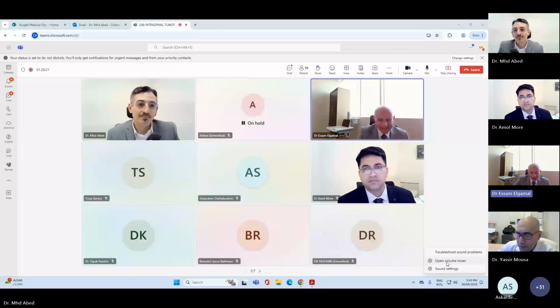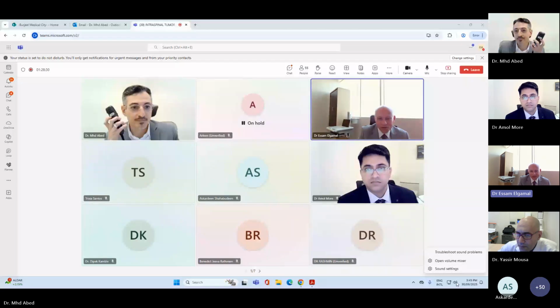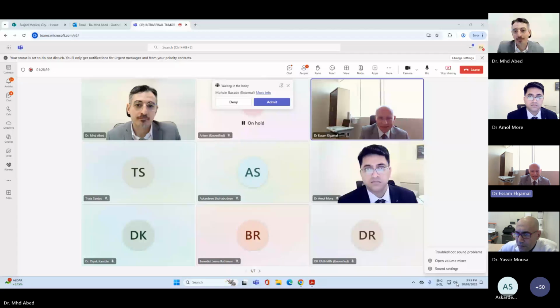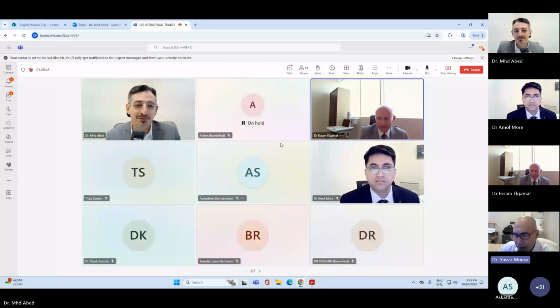The point which I always try to remind the physicians when they request a scan, especially in children, we scan the whole CNS in children. So if you see a spine tumor in children, you have to look at the brain as well. It might be the primary is there, or to rule out any other tumors in the brain. But thank you very much. Actually, you simplified it very, very well, Dr. Adel. Thank you.